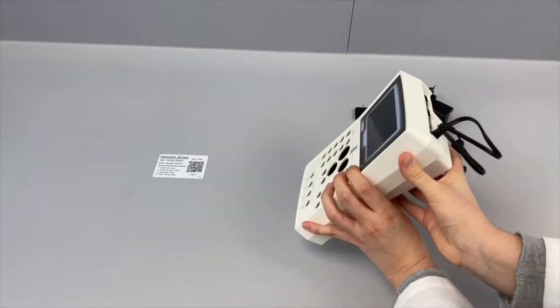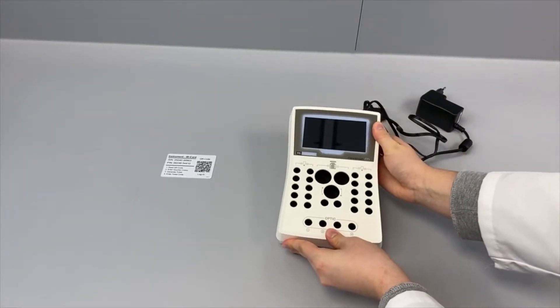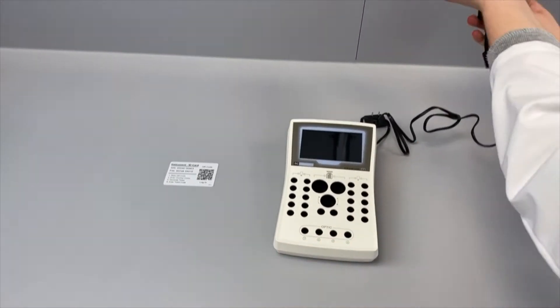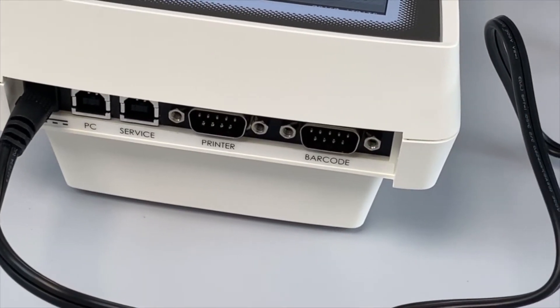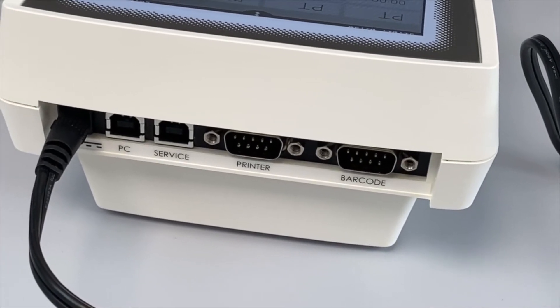Next to the power plug, you can find the connection ports for a laboratory information system, the Severn DAT software, a printer, and a handheld barcode scanner.